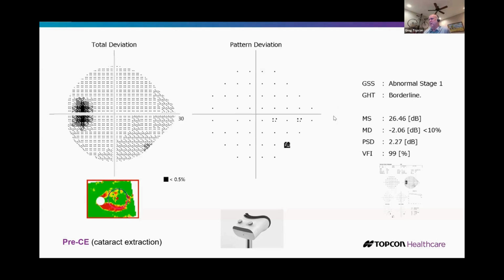And on the next slide, you can see the grayscale there, kind of an uncanny matching of the Hood report. Again, it's not the same. It's not an exact, you're going to have issues. It's just telling you the probability is high, and the reference data says you're in a grouping that's on the low end where you really don't want to be. Anyway, very interesting. This is from our Tempo perimeter.